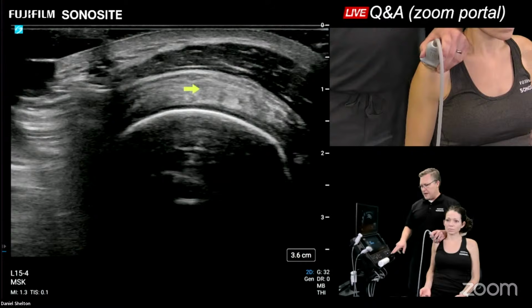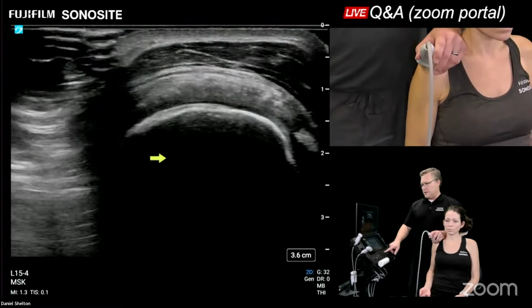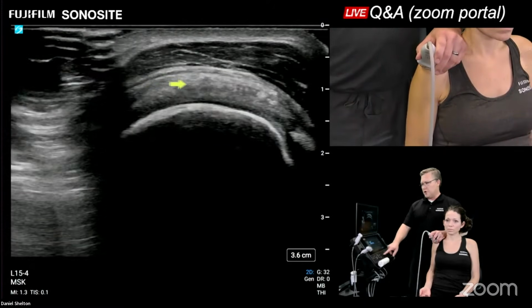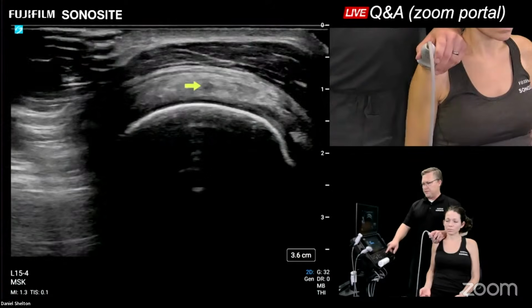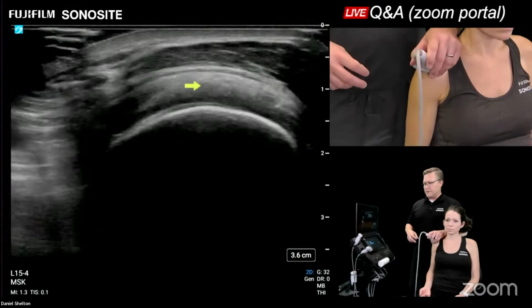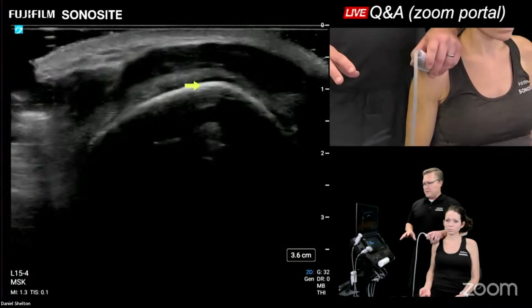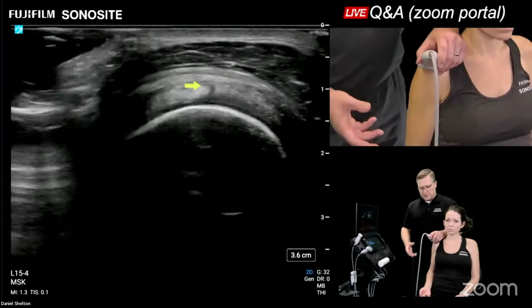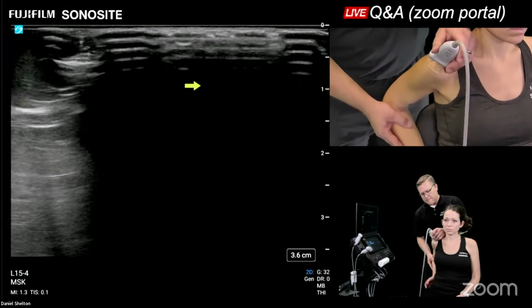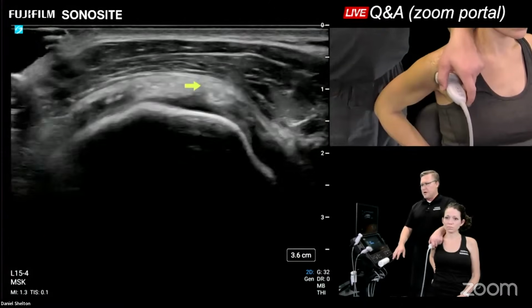Also in this position, I can add compression, and I could go ahead and squish down and see if I get the subacromial bursa to herniate in, because when these fibers are not tight, they're going to behave a little bit differently than when they are tight. But if you don't see a huge volume loss, I'm really not suspecting that this modified Crass is going to hurt our patient, or at least not very much. So it's really just a courtesy to start out with.